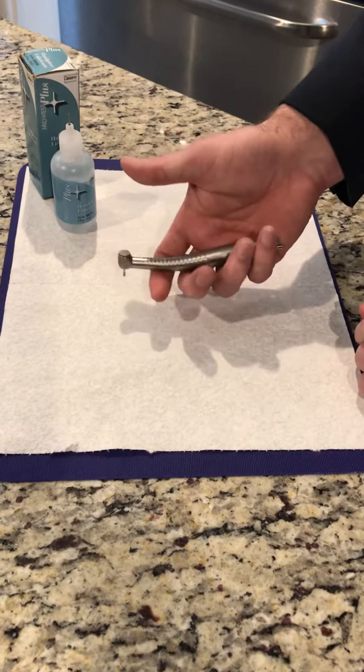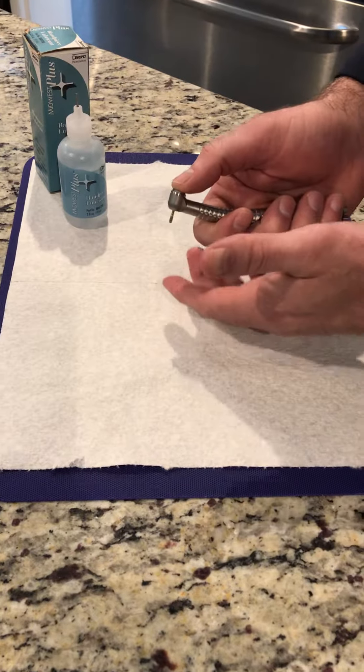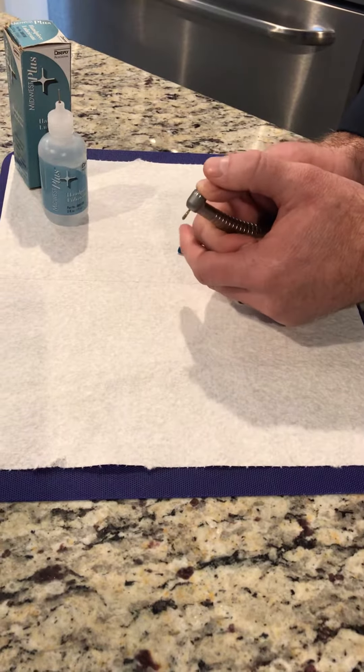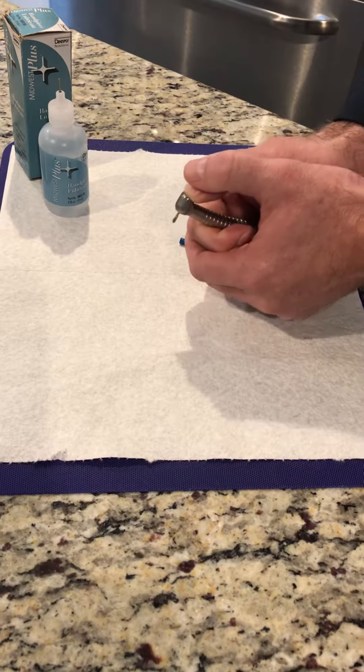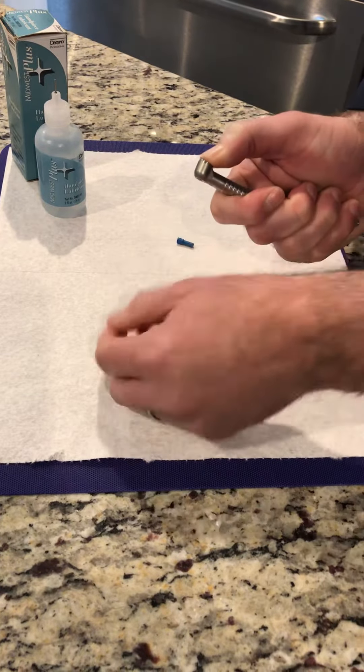Hold the handpiece in your hand almost like you'd hold a golf club, put your thumb on the push button, then put your other hand over it with your thumb on top of your thumbnail, and press down really hard. A lot of times if this has happened, you'll hear a little click and then the burr will come out.